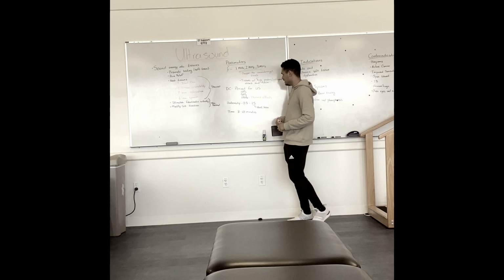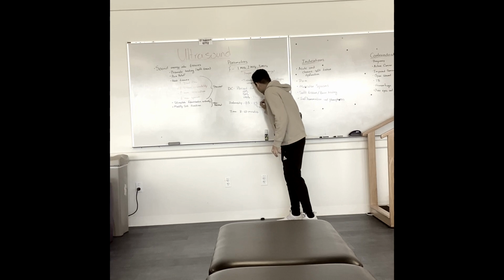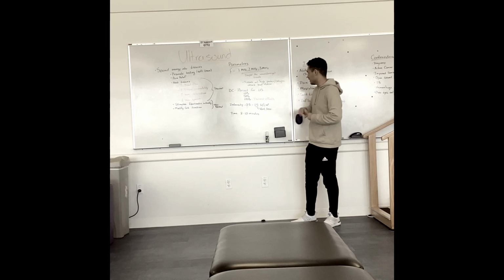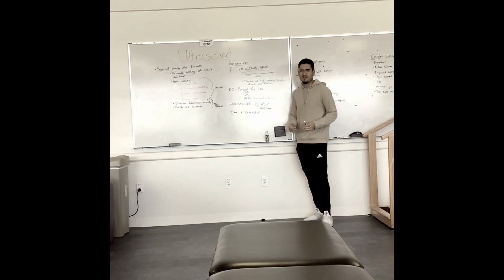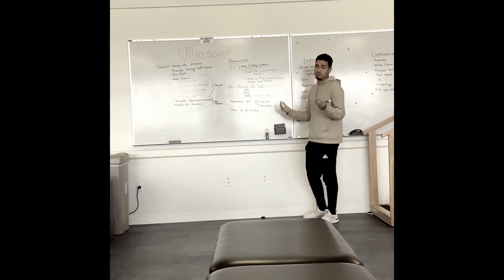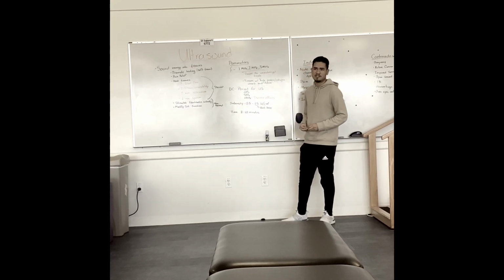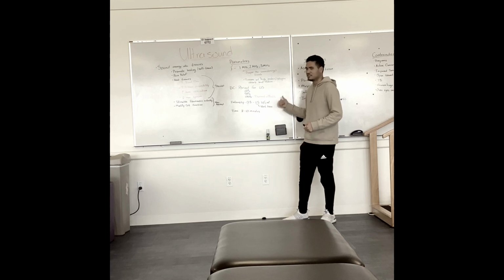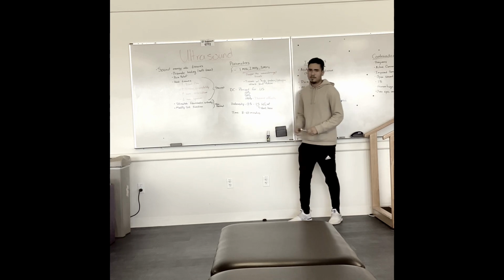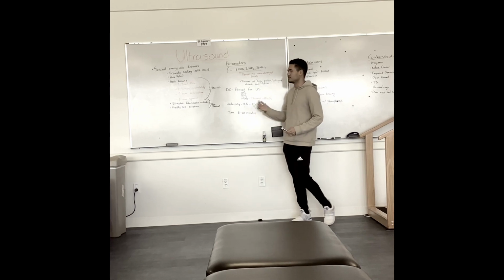All right, so for intensity, you normally have a range of 0.5 to 1.5. And for this, the unit is watts per centimeter squared. So that's the unit we use for describing intensity. You want to start around 1.5. It's just a good baseline to start. And then if it gets too hot, or it starts becoming hot, especially when you're trying to achieve these non-thermal effects, you just decrease the intensity. If it's not hot enough, just increase the intensity, but go off what your patient says. And then the time, about 8 to 10 minutes. You can lower that or increase that, but you want to stick around 8 to 10 minutes when using ultrasound.